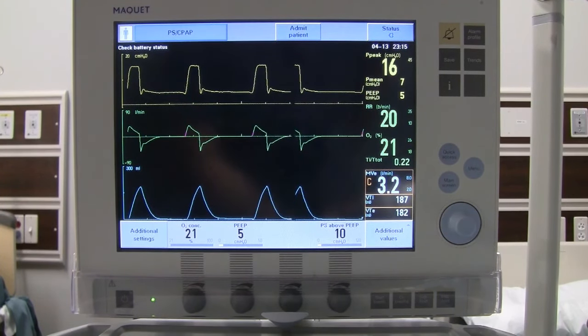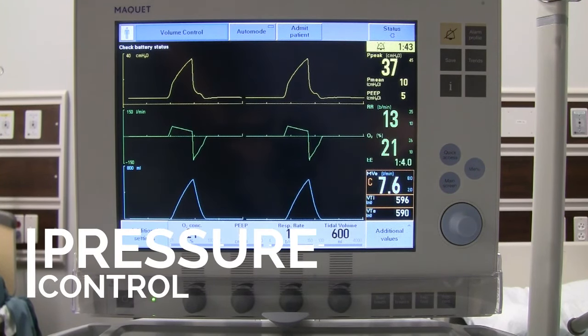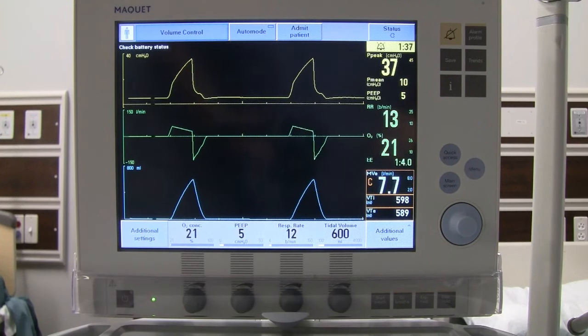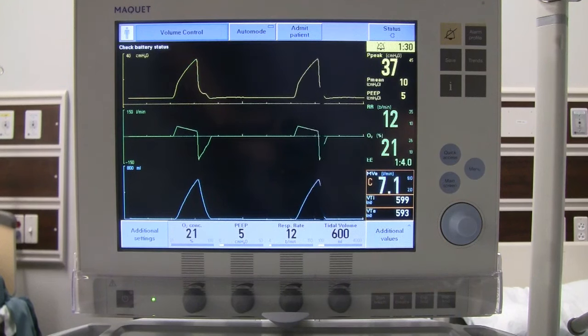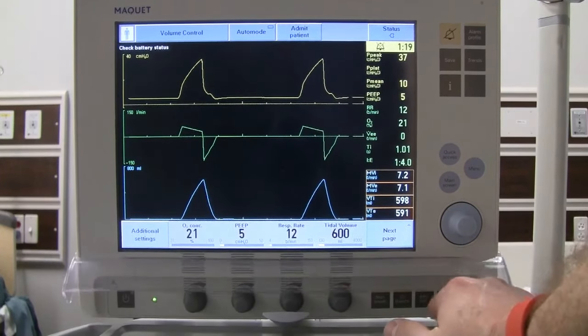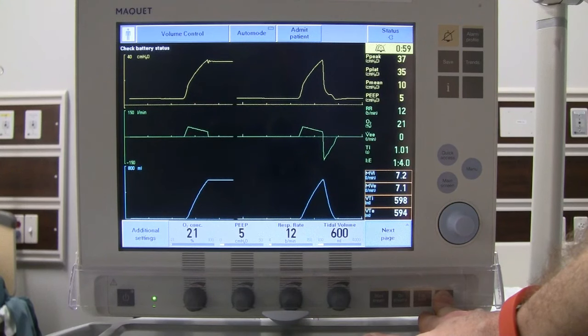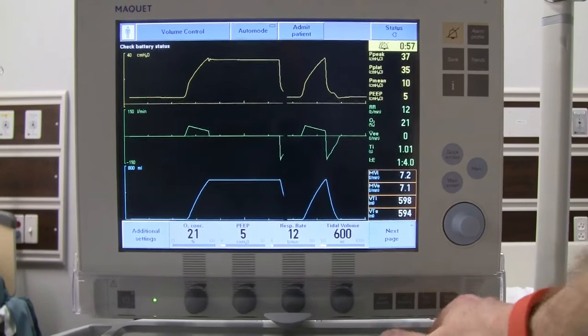That covers all the settings for CPAP with pressure support. Now we've changed back to volume control and changed out our lung mechanics — the patient now has higher pressures. Our peak pressure is running at 37, mean pressure at 10. Getting a plateau pressure by pressing and holding the inspiratory hold button shows a plateau of 35.